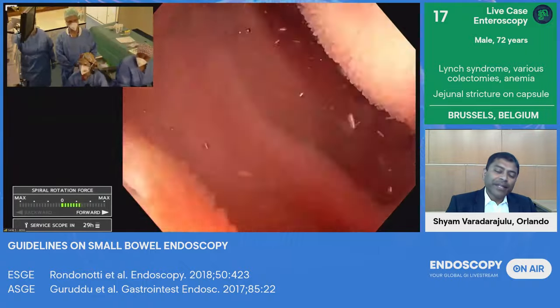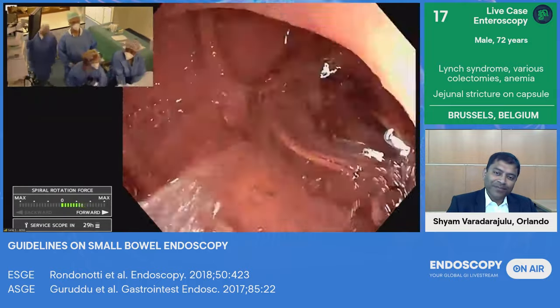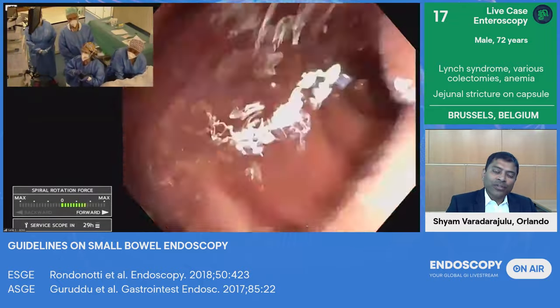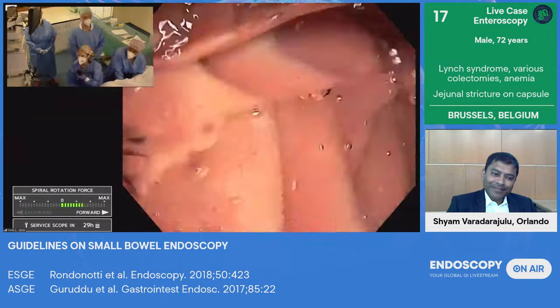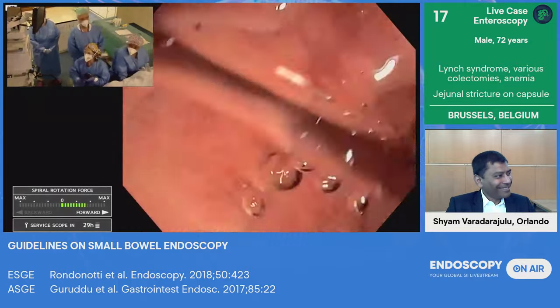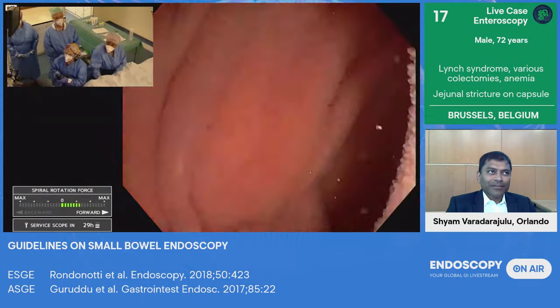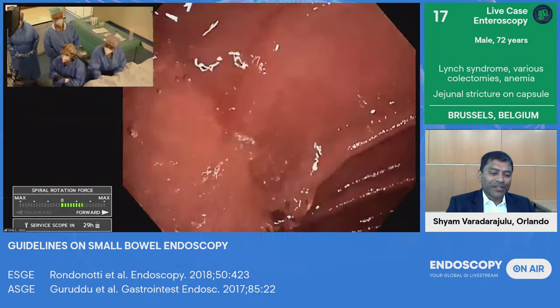So, Jacques, how many centimeters can this scope advance in a normal anatomy in a minute? Is it 10 to 20 centimeters? How many centimeters? I didn't catch your question. I'm sorry. How many centimeters will this spiral endoscope advance in a minute? I never calculated. In the study, we said 4 meters. But usually within 30 to 45 minutes, you can advance three meters. Yes, this is what we have observed, but it's a rough estimate. The math tells me it's about 10 to 15 centimeters a minute.